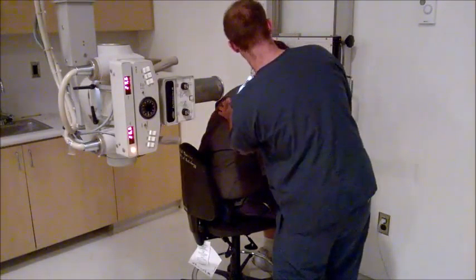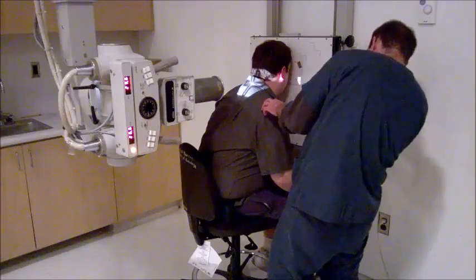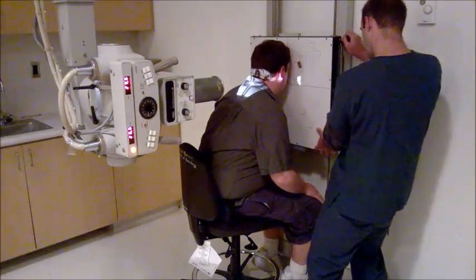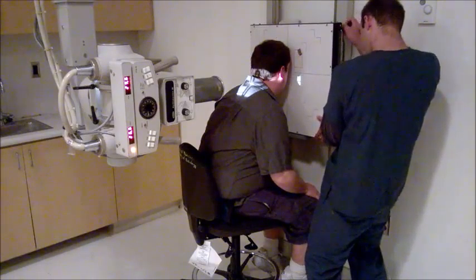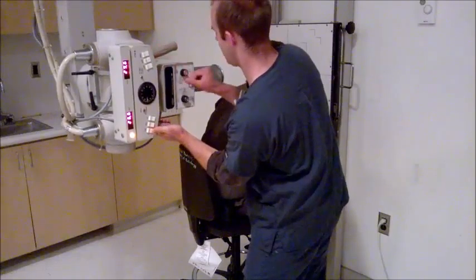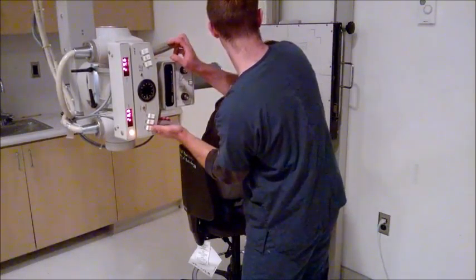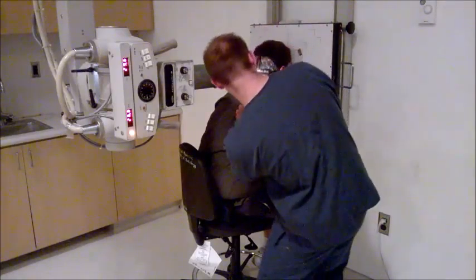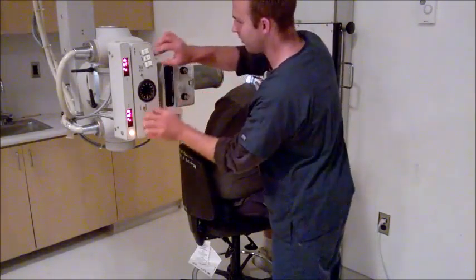I'm going to put my right mark right there, and now I'm going to center at mid-orbit, which is about the nasion right there. So I'm going to bring up the board right there, sir. Same thing with the IR, or the tube. And you're not pregnant, are you, sir? Nope. Okay. All right, collimate a little bit.